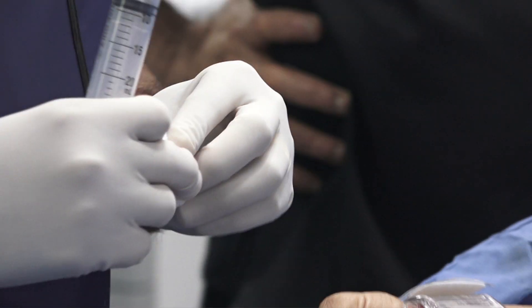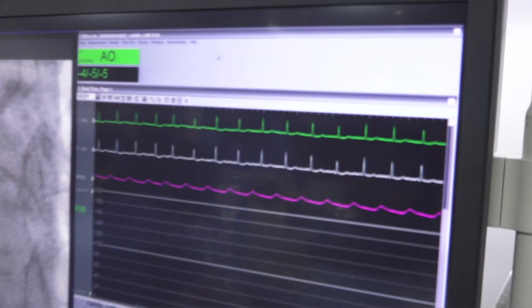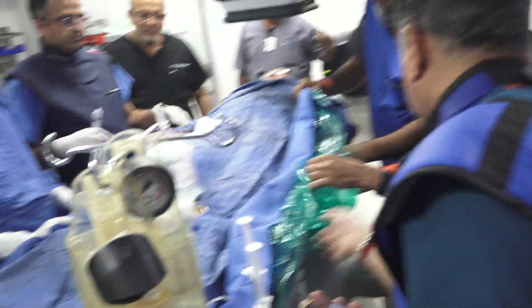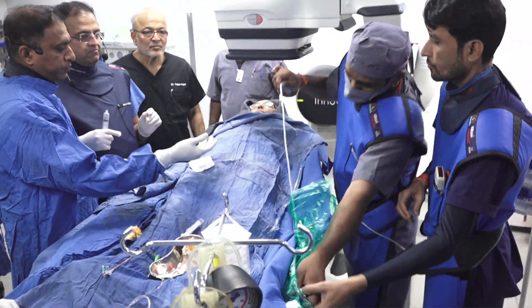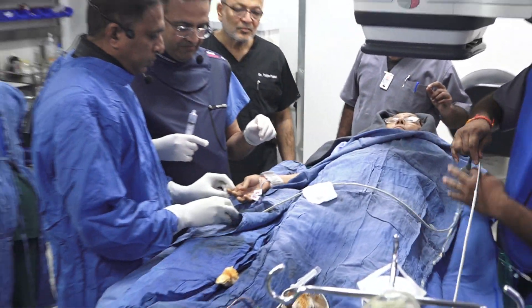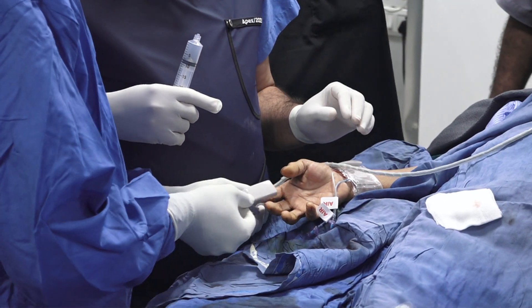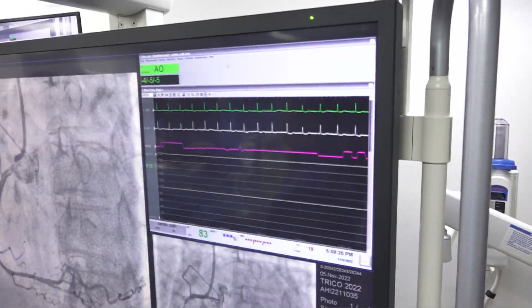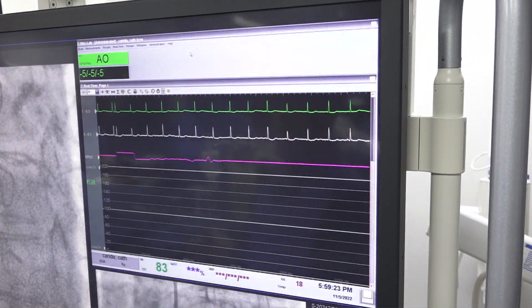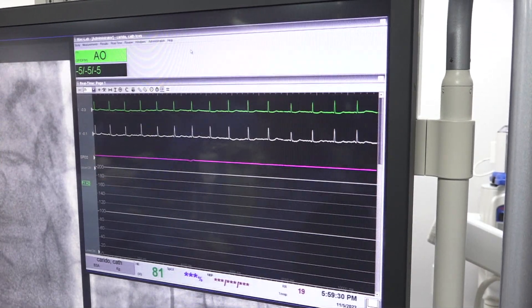If we have the pulse oximeter now, it is on the other side. The ulnar is completely compressed. We are getting radial hemostasis completely without compromising it. The ulnar is definitely fully compressed because right now there is no plethysmographic signal. If you just applied a radial-only band, you would 100% get occlusion.